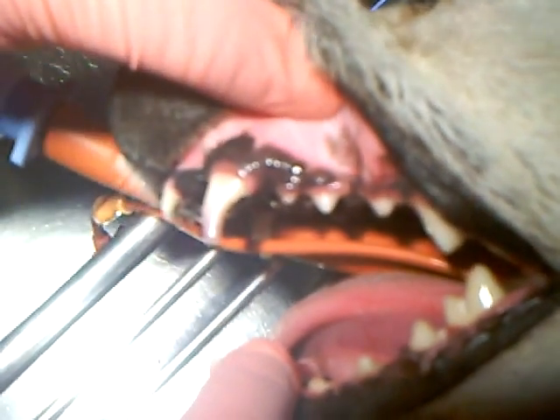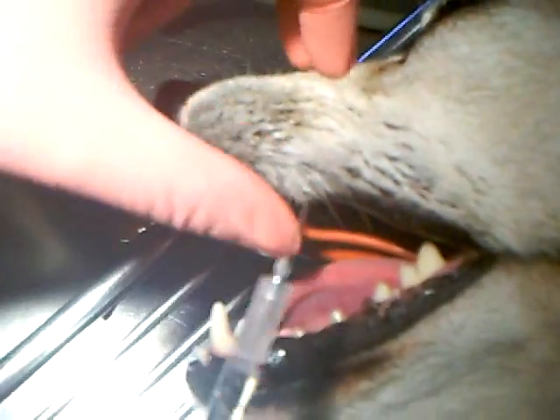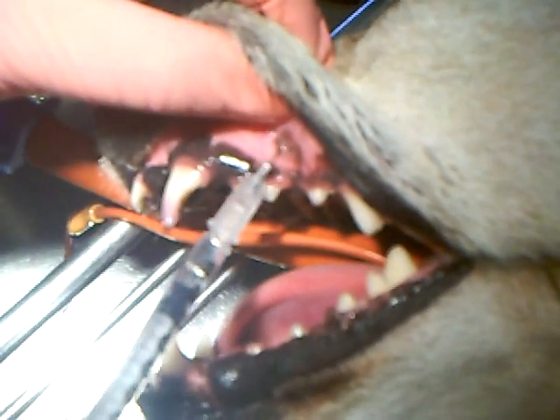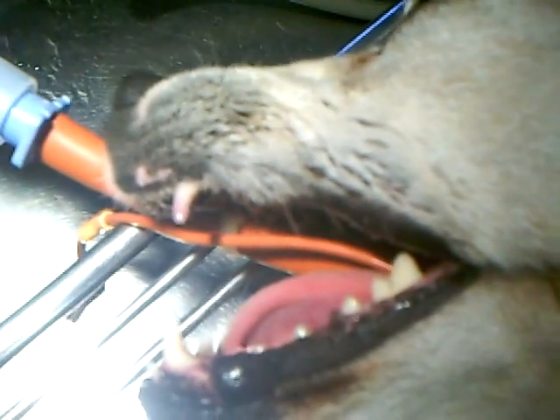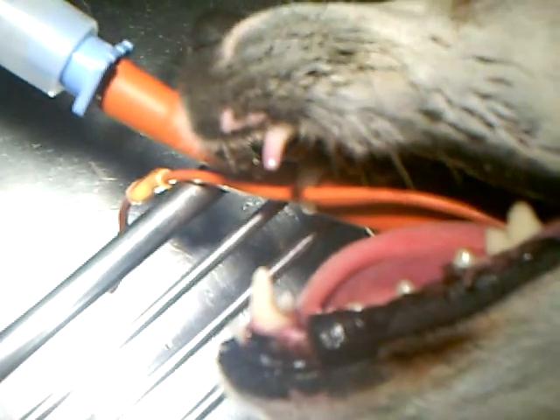So we're just going to go through a little bit what we do when we take out a tooth. What I'm going to start with is I'm going to do a local nerve block in this area to prevent her from having pain when she wakes up. So we're going to put that in there and go ahead and get that blocked.